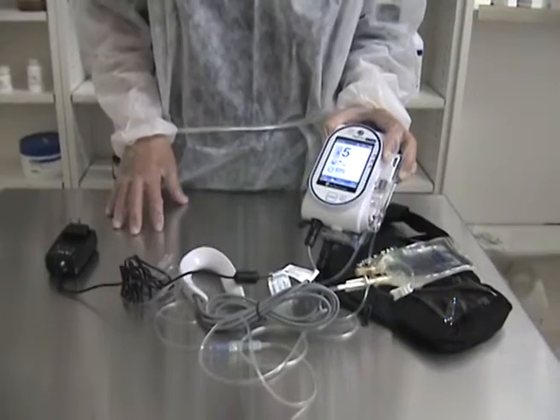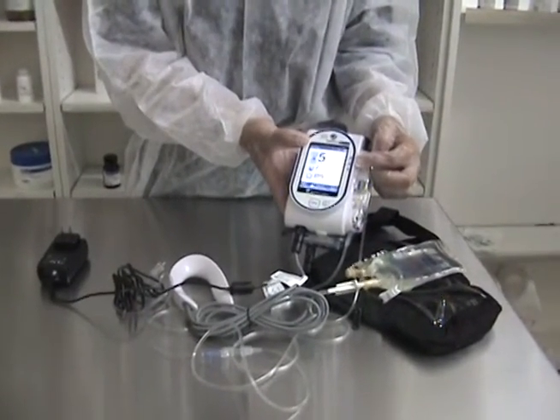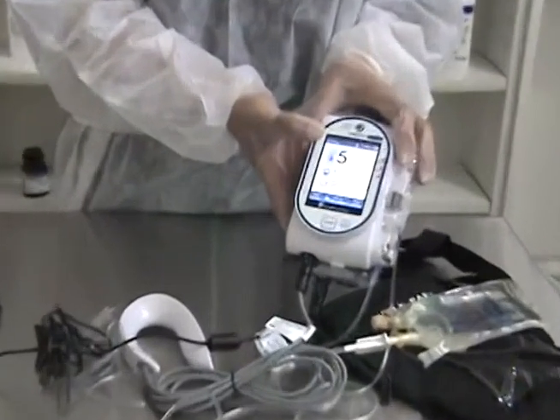Then this end of the power cord will be plugged into a wall outlet. When the battery is charging, you will see the charge light illuminating, indicating that it is being charged. When it's a solid light, it is fully charged.